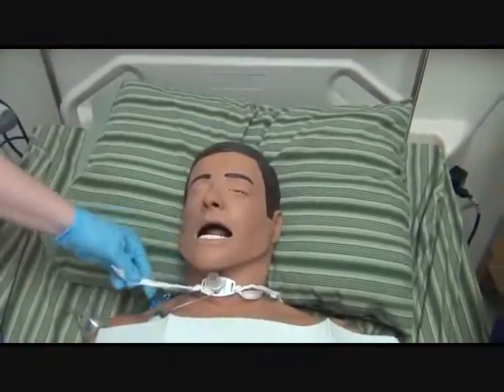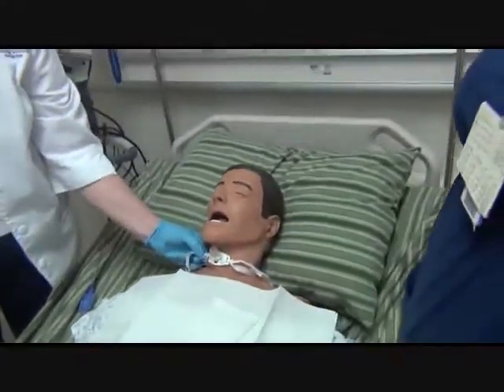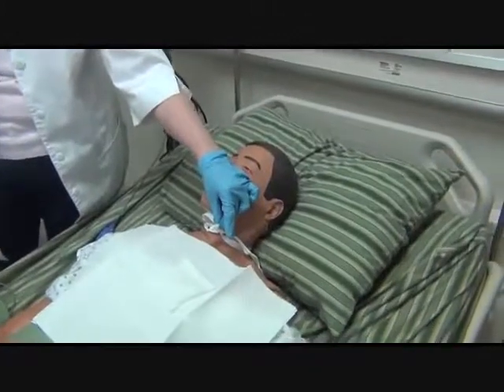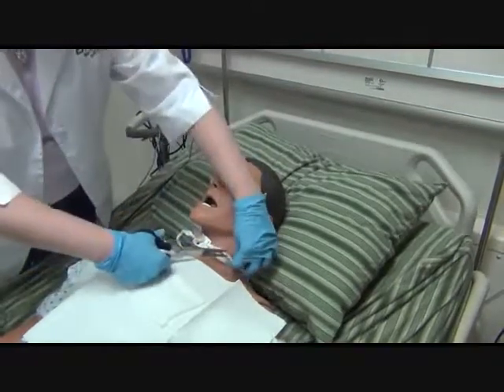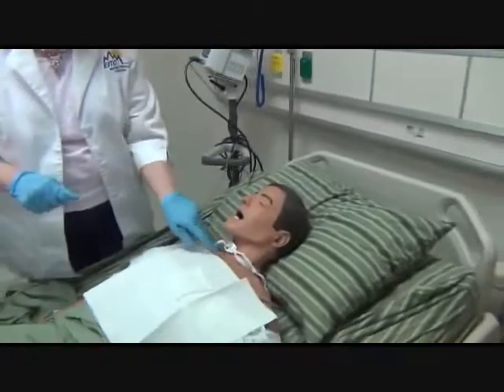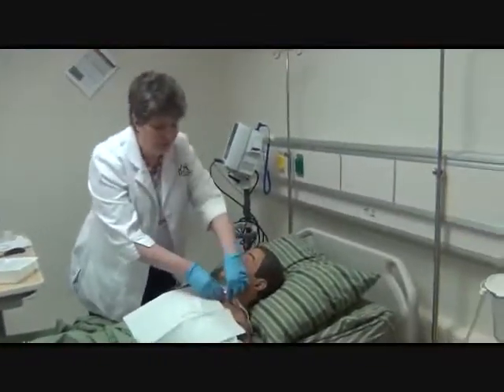You want to trim these ties so that they're long enough that if you had to get a hold of it and do another tie, you could. But you don't want it long enough that it can possibly go in and get into the airway. So we're going to take the time to just do a little trim if you do a double knot like this. Okay. Now I'll demonstrate another one.